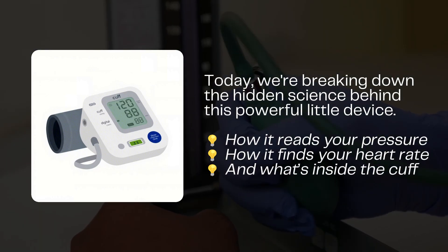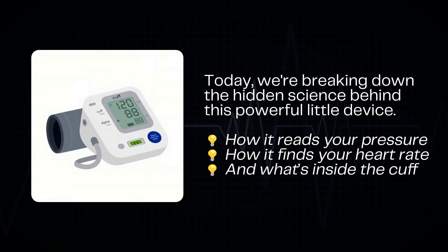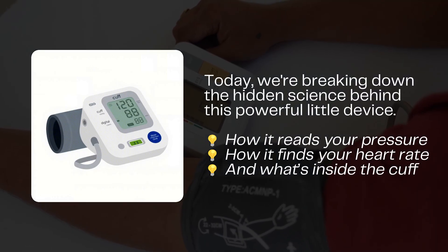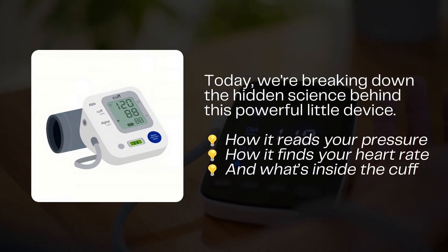understanding your home blood pressure monitor can help you use it more effectively and confidently. We'll walk through what's inside the cuff, how it detects your heartbeat and blood pressure, and how it converts vibrations in your body into the numbers you see on the screen. Let's get started.